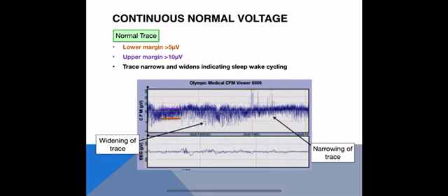Continuous normal voltage is a normal trace. We look at the amplitude of the wave pattern and can see that the lower margin is greater than 5 — depicted by the orange line — and the upper margin is greater than 10 — depicted by the purple line. The trace also narrows and widens in places, indicating sleep-wake cycling, which as we discussed is a normal and desirable finding.